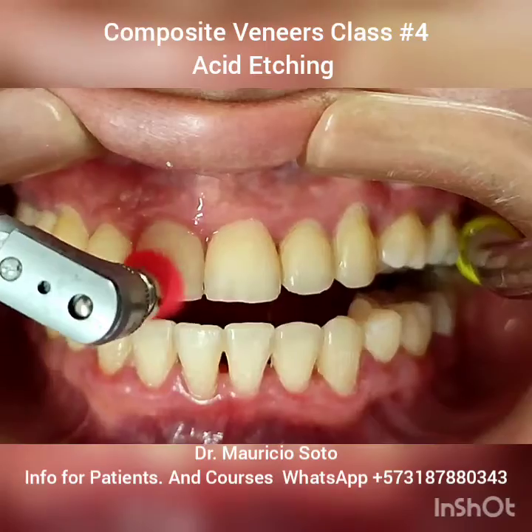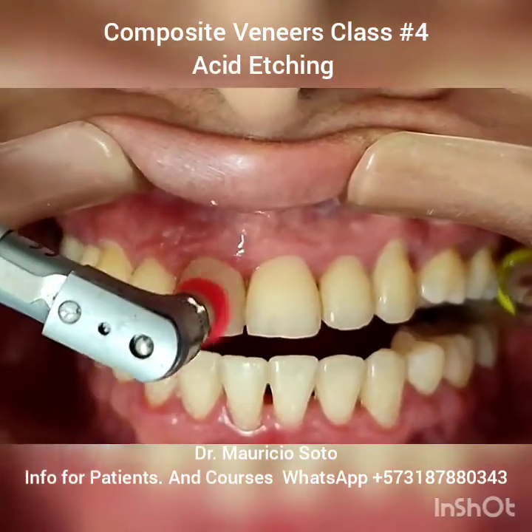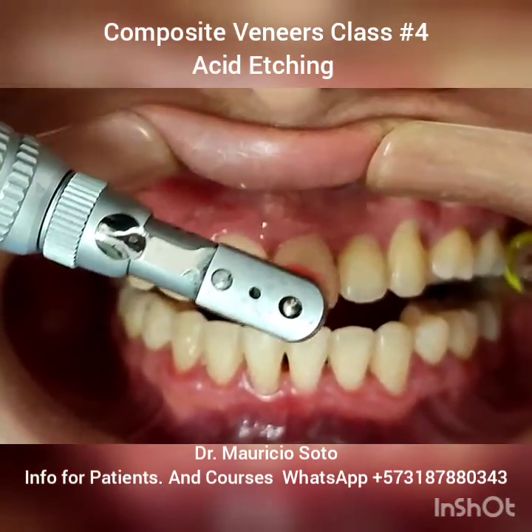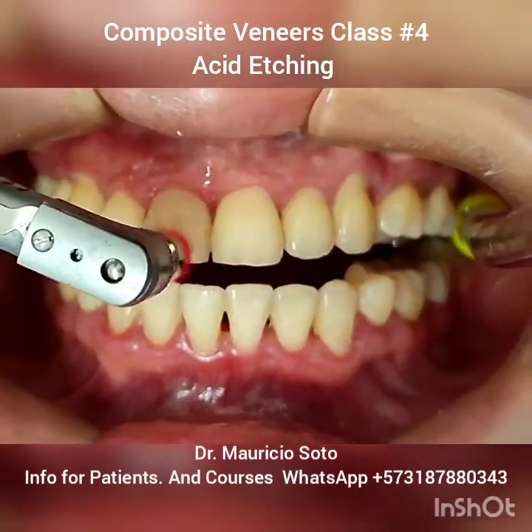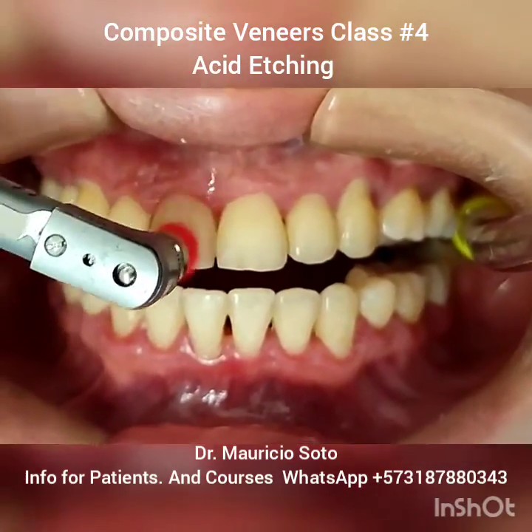The first thing that we need to do before a bonding procedure or composite veneers is to clean very well the surface, because if we don't have a very clean surface, we have failed in the bonding process.